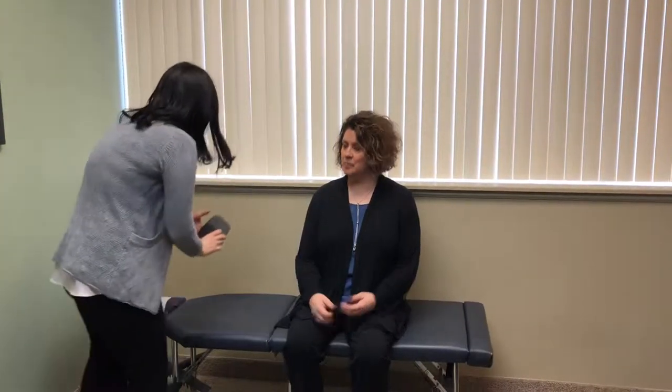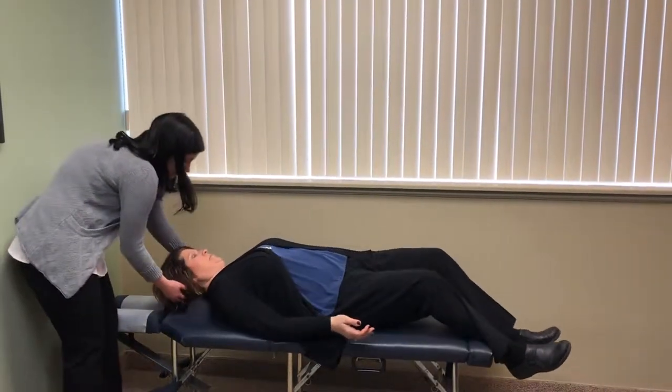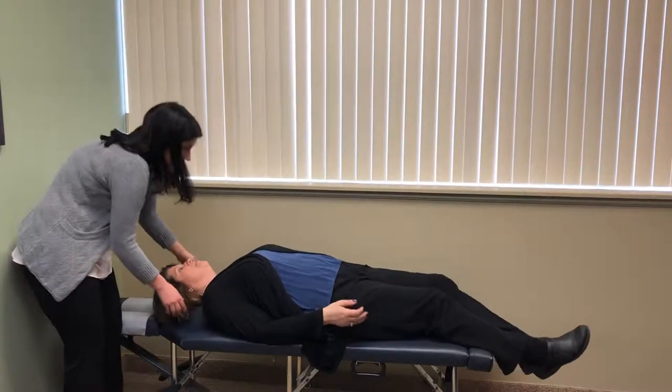I want to show you how to use it because I get so many questions about this. There are two sides to the apex — a slanted side and a rounder side. The slanted side is going to be the one that your shoulders go towards, and the neck is going to go over top of it. Lynn, will you demonstrate how we lay on that? We have the slanted side there, and then Lynn's going to bring this right underneath her neck.